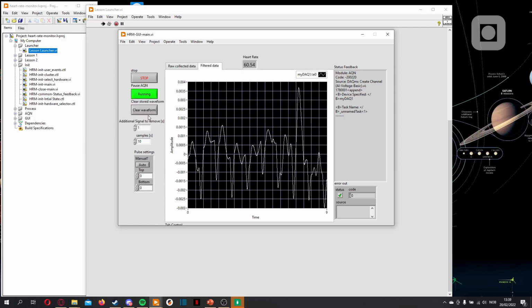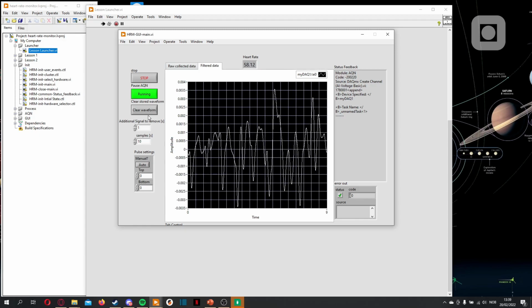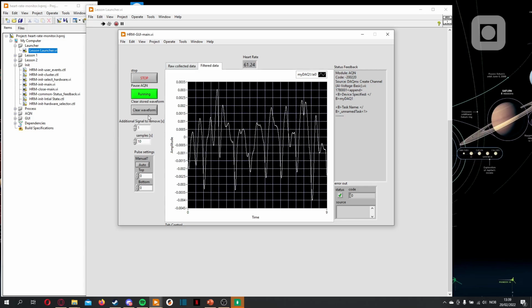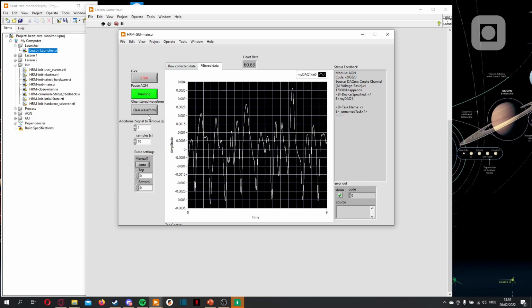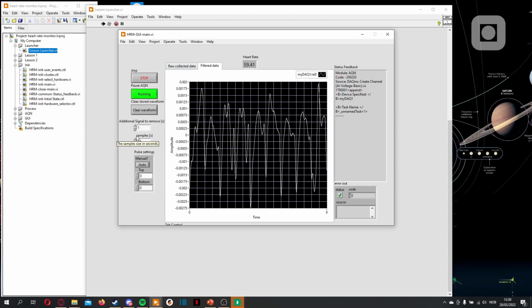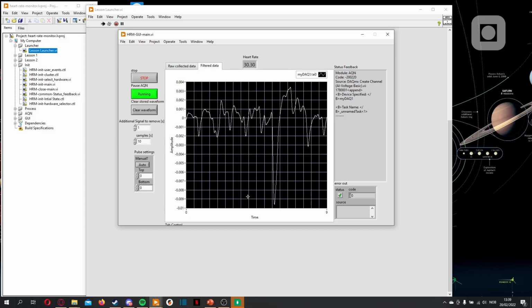Now I'm getting a more consistent result, but I still get a little bit up and down because the measurement we take is very sensitive to any interference, moving your fingers, moving the light, having weak light, etc. Since I added a really strong light, I changed to my little finger, because it's the thinnest finger, and now I'm getting the correct results. So if you have any struggles with this, it's very understandable because of the little hardware we use. Basically, talking interferes. I get a lot better result when I'm not talking.